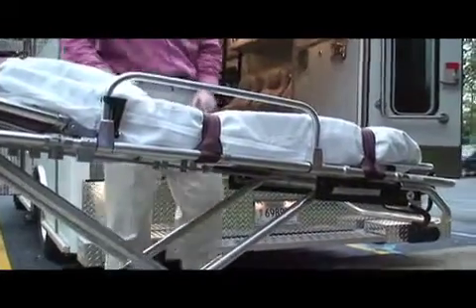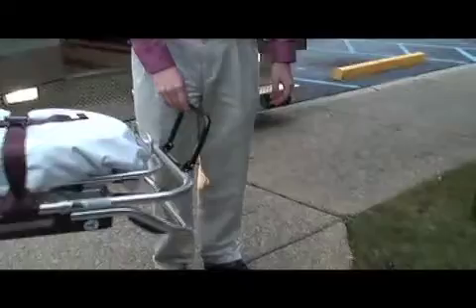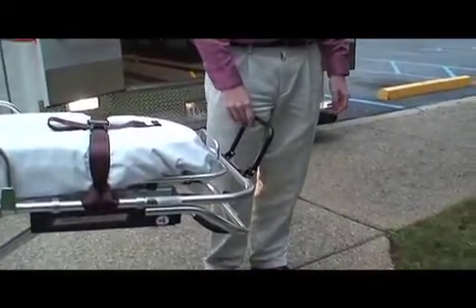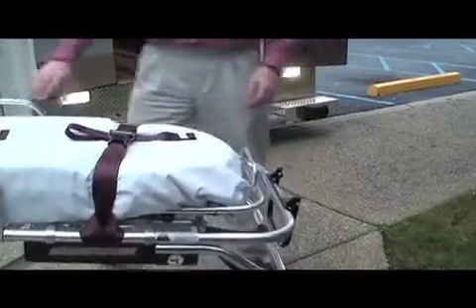Use whichever is most comfortable for you. Okay. On the end of the stretcher, you'll notice a handle. This handle can be used to pull the stretcher so that you're not having to bend over constantly, and that will help make life a little bit easier.